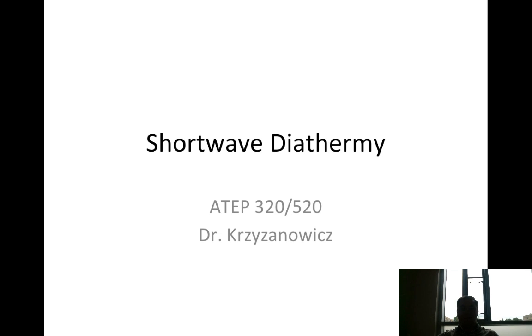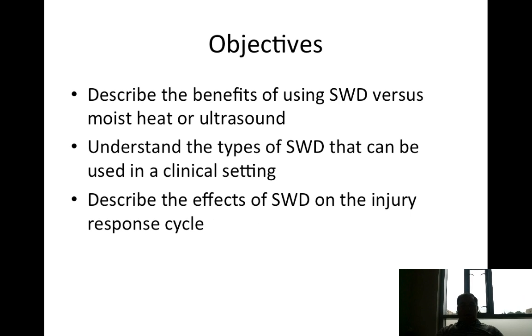Okay, so today we're going to talk about shortwave diathermy, which is a deep heating modality that, at least up here in Massachusetts in our clinical sites for our students, nobody really uses. I think actually only one of our clinical sites has a diathermy, and every time I go over there to visit the site, they say they use it once or twice a year. So you'll see the abbreviation SWD, that's shortwave diathermy.